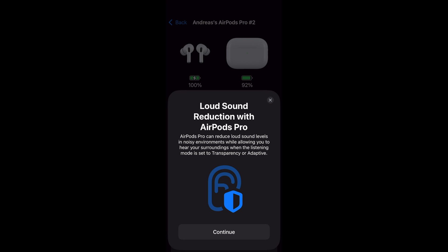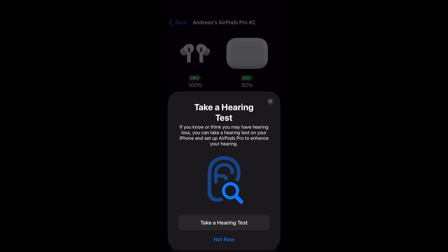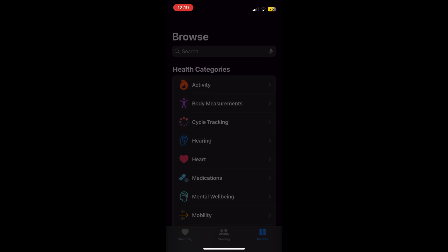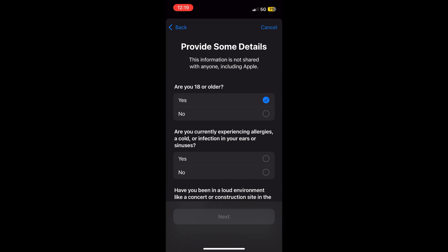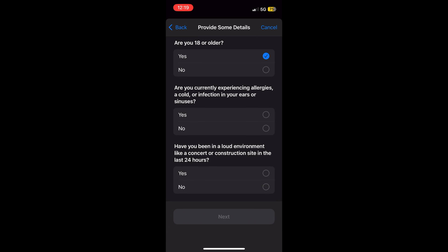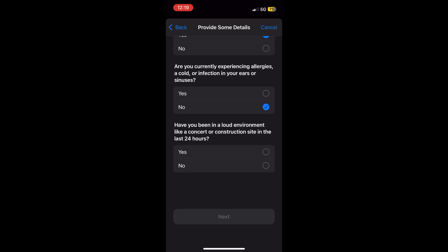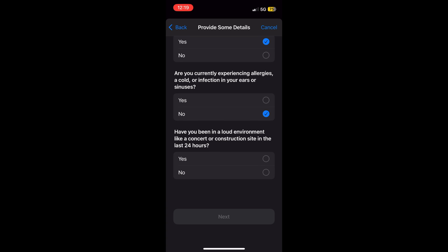Apple describes this as a scientifically validated test designed for adults. Additionally, a hearing aid mode offers clinical-grade sound adjustments in real-time, boosting sound clarity during calls, media playback, and ambient listening.